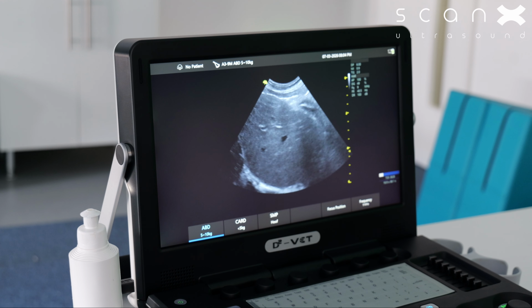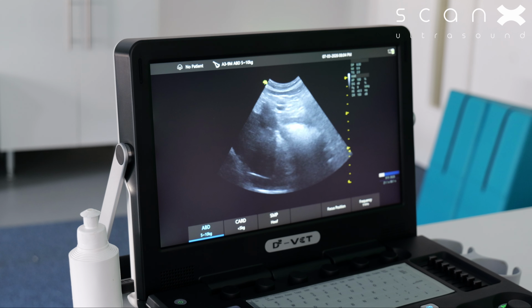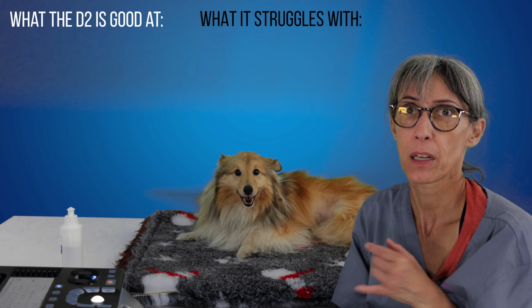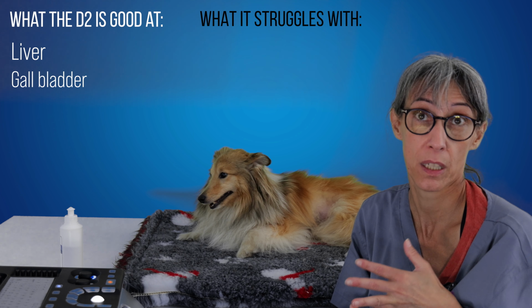The liver, you're able to identify most of the things there, absolutely fine. Liver is fine, and intestine. The liver parenchyma was fine. Gallbladder sludge, you can see it, but not as clear as on other machines.